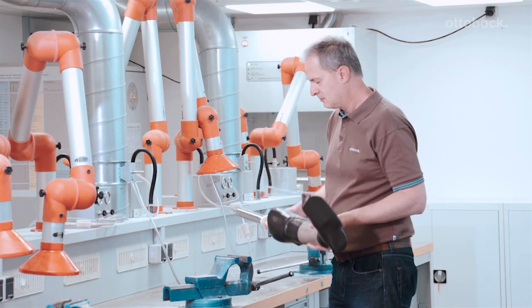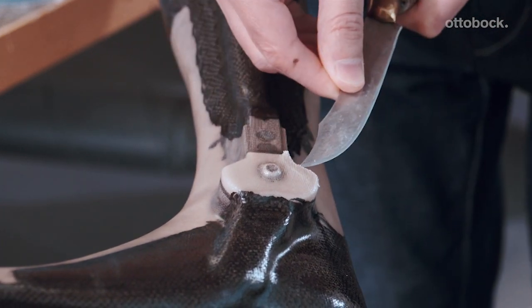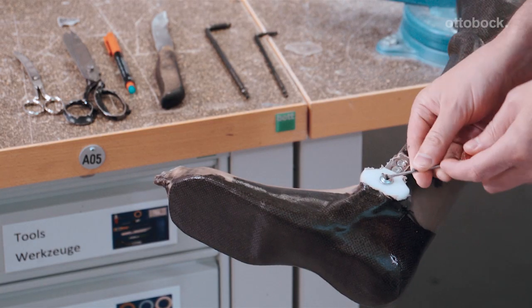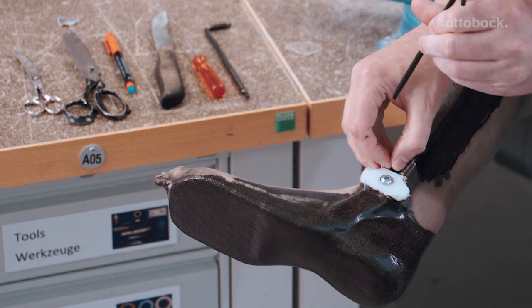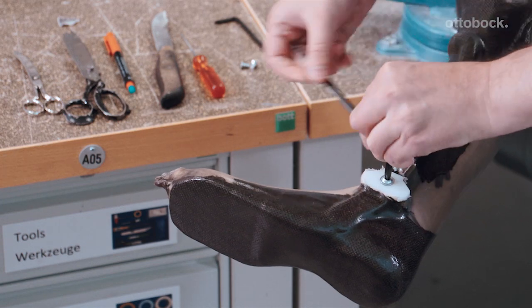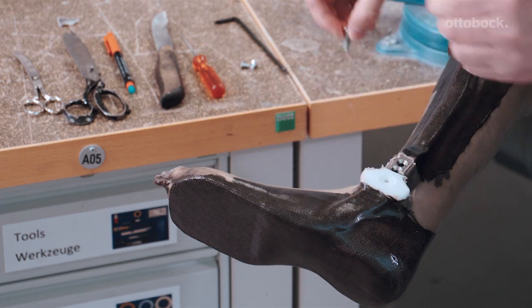Once the laminate has hardened, the laminated orthosis blank is removed from the plaster model. Use a knife to cut the lower dummy section and the dummy cover free. Remove the screws on the bar component and the dummy screw from the plasticine. Then remove the two screws on the bar component and loosen the dummy screw connection. Remove the dummy cover.